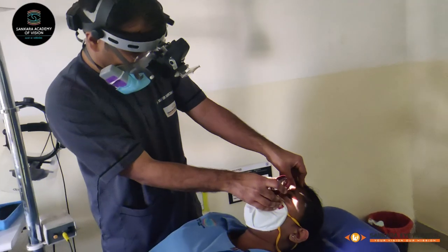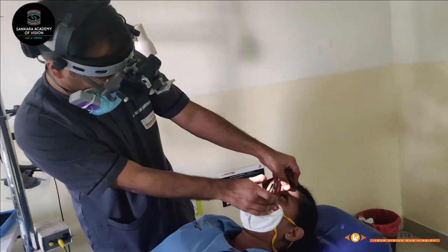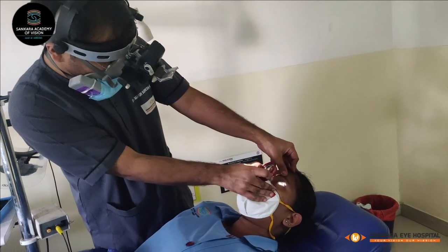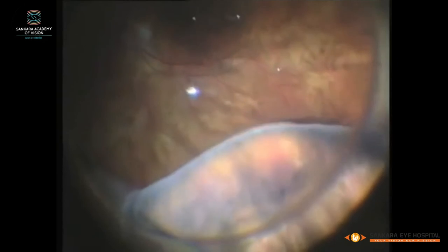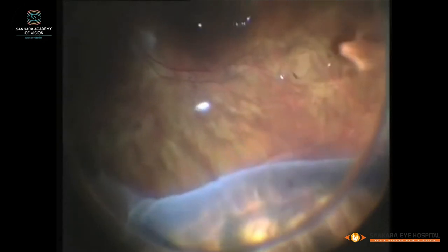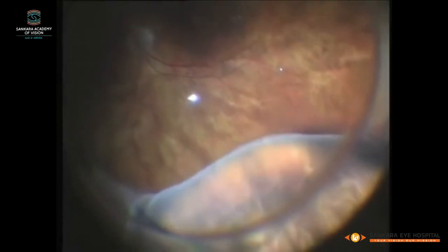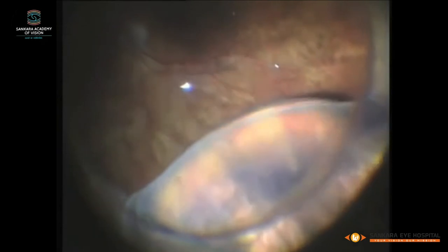The peripheral most of the retina and pars plana region bows inward, making direct visualization of this portion difficult. Depressors are needed to indent the sclera, pushing the peripheral portion inward to bring the area of interest into focus.